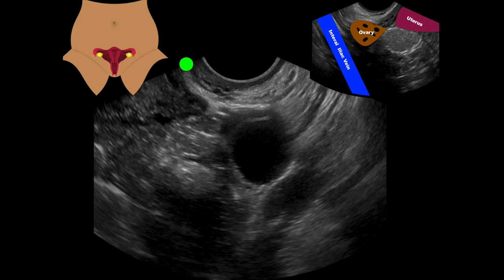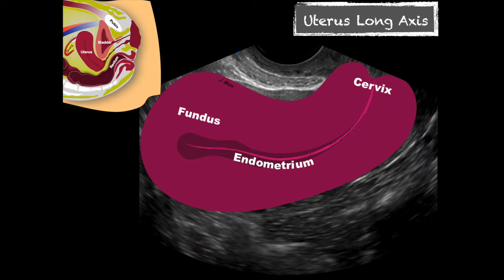If we're doing this for pregnancy, this is when I go back and evaluate for where it's located. We'd want to see that pregnancy right up in the uterine fundus within the endometrial canal. In our long axis view, we'd look for an anechoic structure which could represent a gestational sac, and then a small bright structure within that which would represent a yolk sac or maybe a fetus. If we don't see it in the uterus, we need to be concerned: is this a miscarriage or is this in the wrong location?